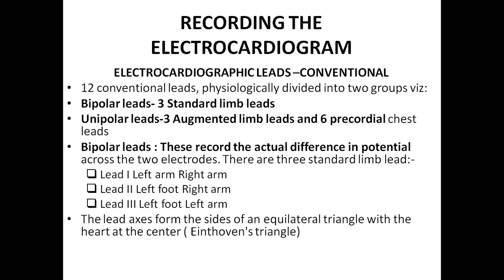Okay, leads means, if you have ever taken an injection, the needle it has, that is not what we call the leads. Here these leads are nothing but, this is not an invasive technique inside the skin. This is a non-invasive technique. It will place the electrode just on the skin. Okay. So for the unipolar leads, these are 3 augmented limb leads and 6 precordial chest leads.